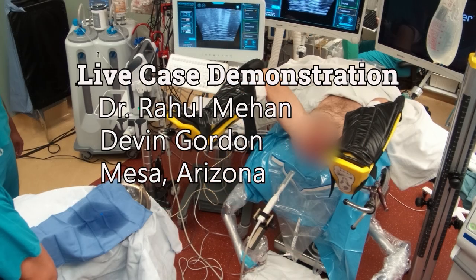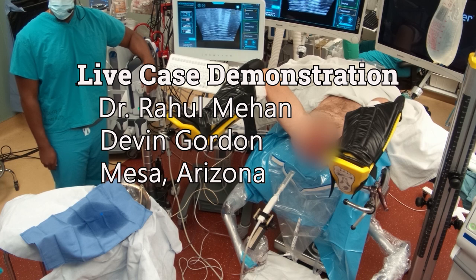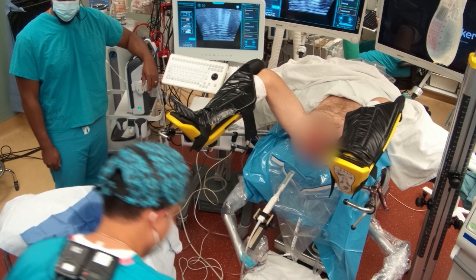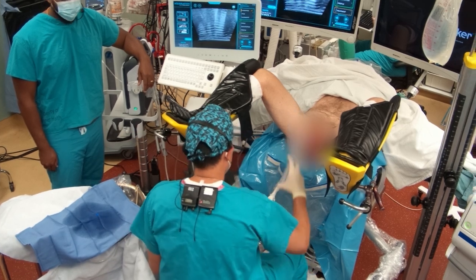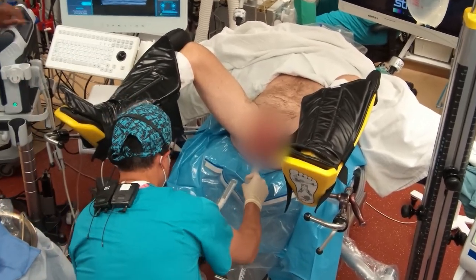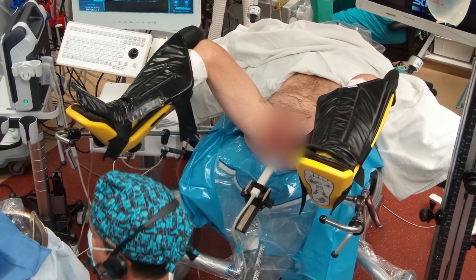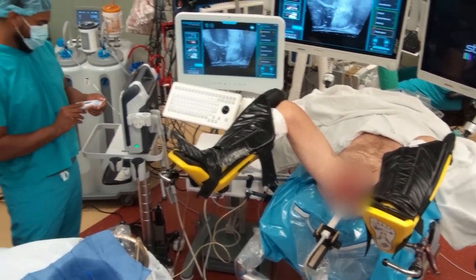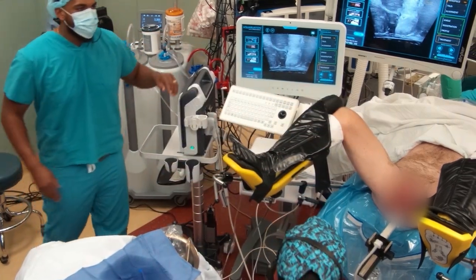I'll walk you guys through this. This is a big prostate — a 74-year-old gentleman with a 280-gram prostate on MRI. I use about a whole syringe of lube. We are using this HR lubricant. In my personal opinion, it's more echogenic.